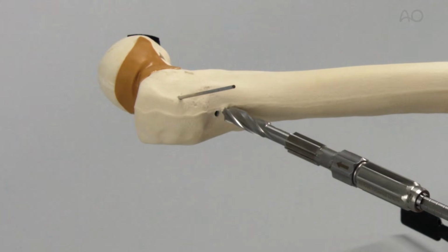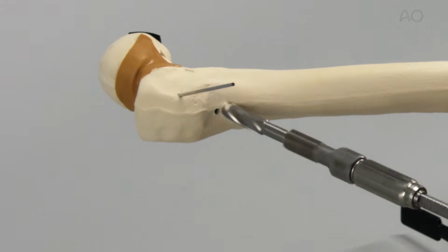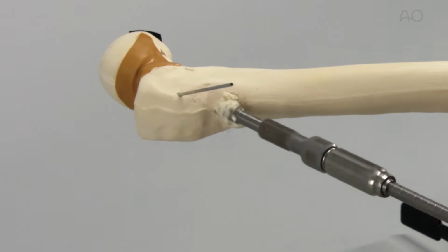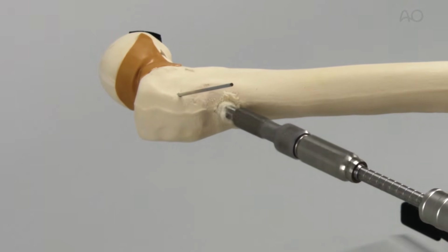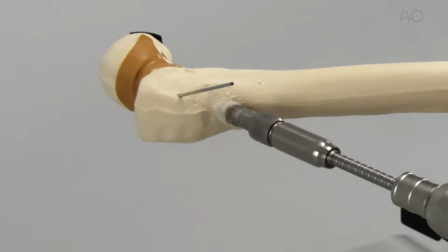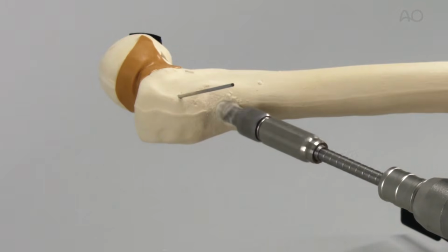The reamer is advanced down to the stop to ensure that the plate fits flush to the bone. Note that reaming includes all 3 levels of the reamer. Clinically, in the situation of dense bone, the use of continuous irrigation is recommended to prevent thermal necrosis. Image intensification is used to verify the reaming depth.